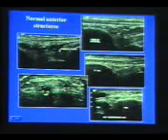These are normal structures which you will look for. This is the dorsalis pedis, and then the extensor hallucis longus, the tibialis anterior muscle, extensor digitorum longus, the anterior tibiofibular ligament, and then the cross section showing all these tendons with vessels. This is tibialis anterior, extensor hallucis longus, and digitorum longus.